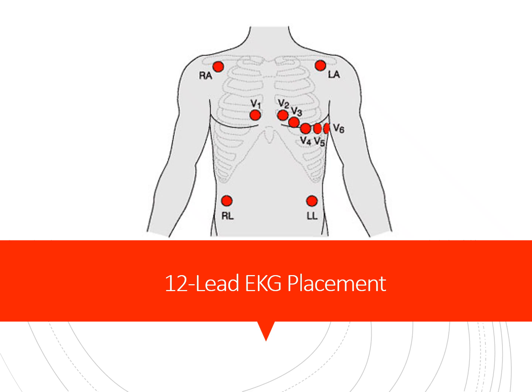A couple of common pitfalls to mention: placing V1 and V2 too high can produce a QRS complex that mimics a septal MI. Also, if limb leads are reversed, it can change the axis and lead to a misinterpretation of rhythm or even suggest the wrong location of a STEMI. Clinically, if a rhythm doesn't fit the patient's symptoms or presentation, it's always better to double check the lead placement before escalating or activating a STEMI alert.